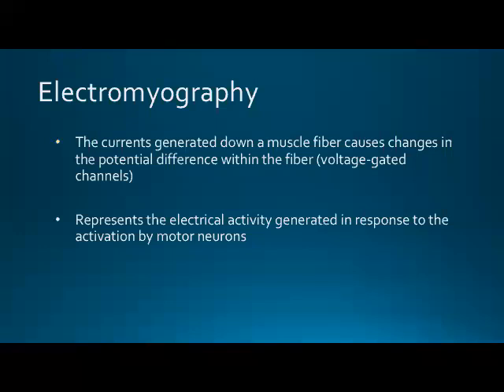If we move our exterior surface electrodes down the muscle belly along the skin, then we'll start picking up potential, but that potential will decrease as we move further and further away from the innervation zone. So at the innervation zone, we have a zone of cancellation, so a zero signal.